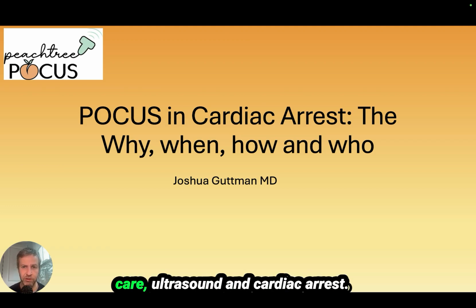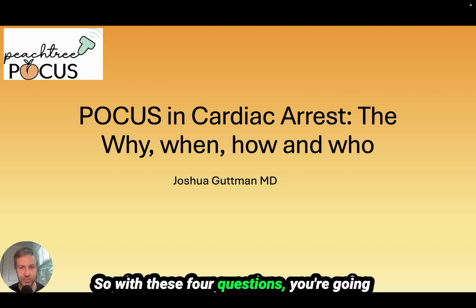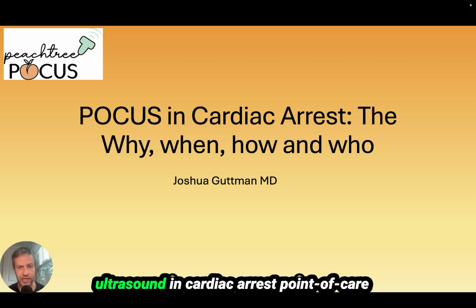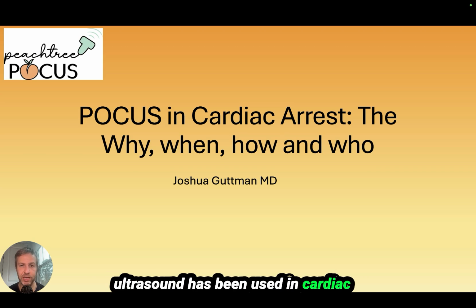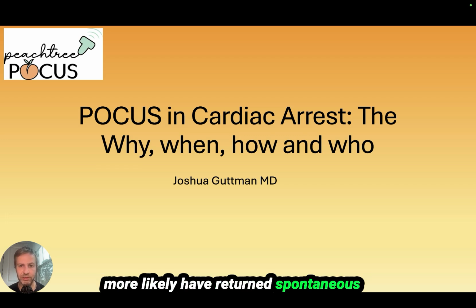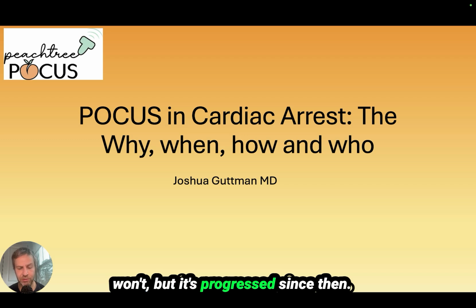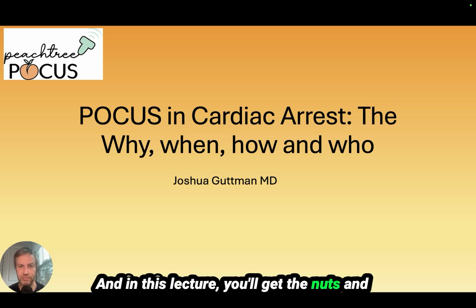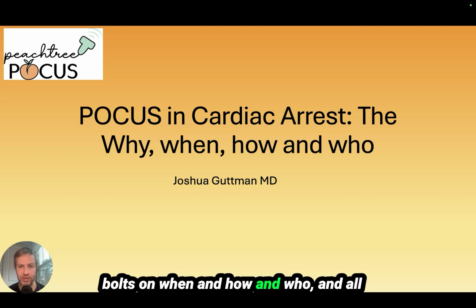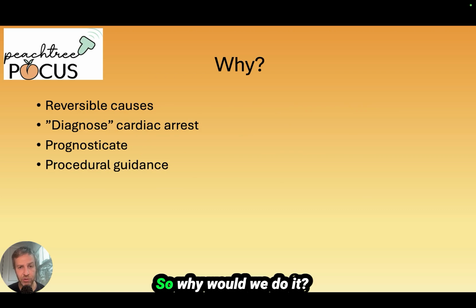Today we're going to talk about point-of-care ultrasound and cardiac arrest, the why, when, how, and who. With these four questions, you're going to discover how to use point-of-care ultrasound in cardiac arrest. It has been used in cardiac arrest for a fair amount of time now, initially just to prognosticate who will more likely have return of spontaneous circulation with survival to hospital discharge neurologically intact, and who won't, but it's progressed since then. In this lecture, you'll get the nuts and bolts on when, how, and who, and how to incorporate it into your practice on your next shift or your next patient with cardiac arrest.